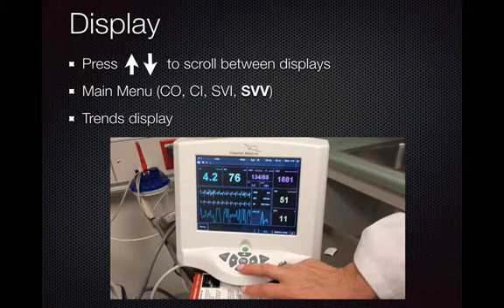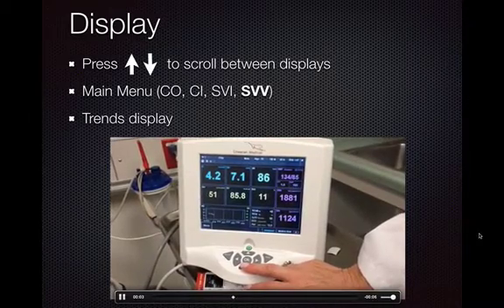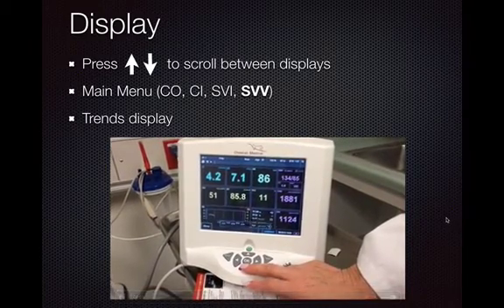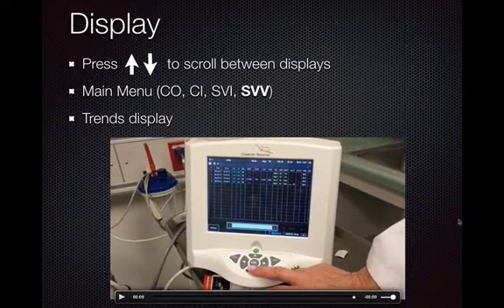Once your calibration is done, you get to see some really cool measurements. Basically, you have your cardiac output right here, your heart rate, blood pressure, your vascular resistance right here, and stroke volume index and the stroke volume variation right here. You can actually toggle between screens by pressing the up and down buttons right here. And you can see that there are different displays that you can use, including a trend display, which is pretty cool. It'll plot some of your key data over time.